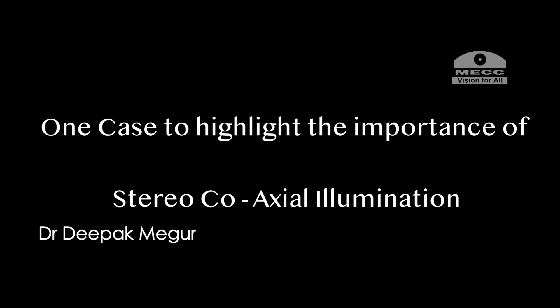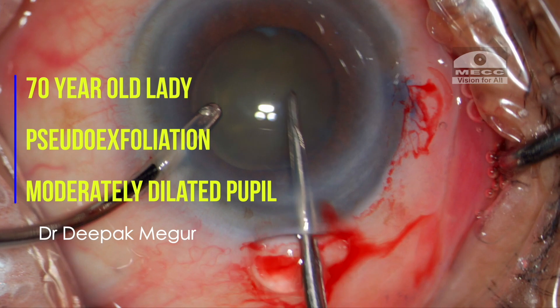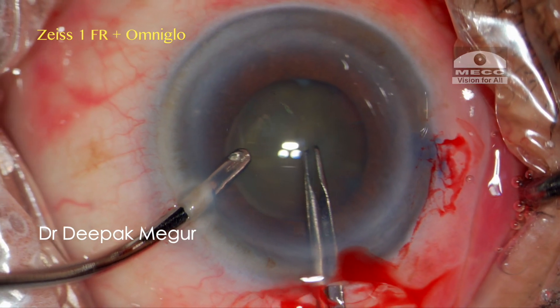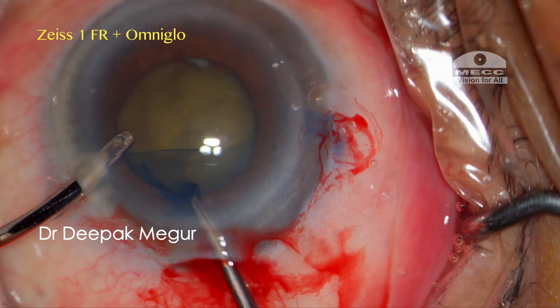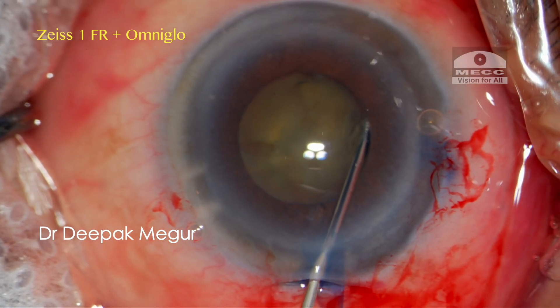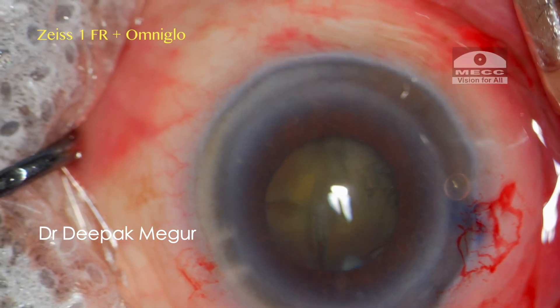This is quite a representative case — an elderly lady with a slightly smaller pupil, pseudo exfoliation, and dense cataract. The zonules are quite loose, as evidenced by wrinkling of the capsule. With the help of a forceps, an adequately sized rhexis is created. I believe the most critical step in eyes with loose zonules is hydrodissection. I carefully perform hydrodissection by injecting small amounts of fluid at different quadrants until the nucleus is totally free from its attachments with the capsule bag.